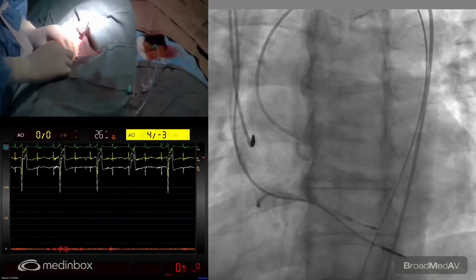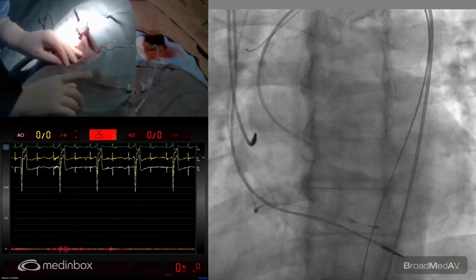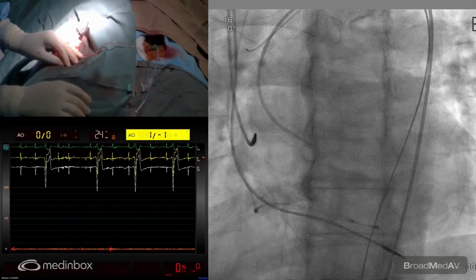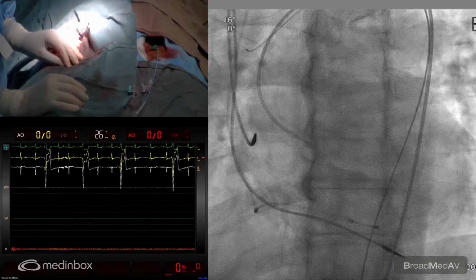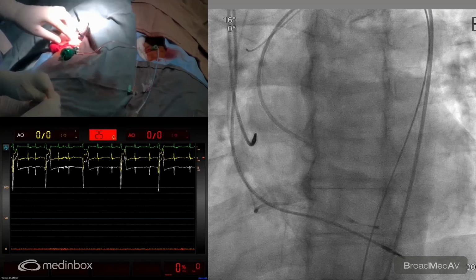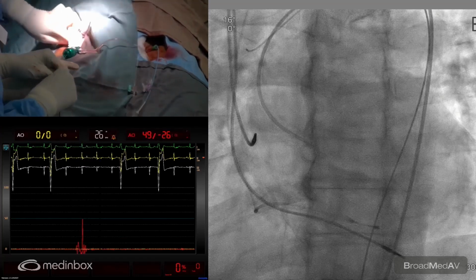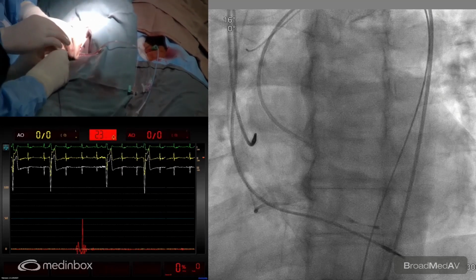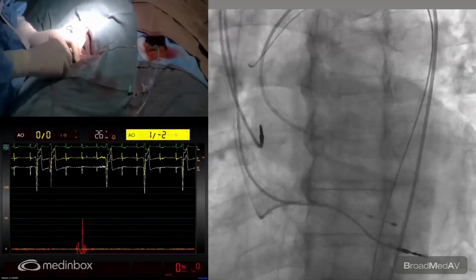The only question is now whether to dilate it because of the AR. I will keep the valve ready and then dilate it. Why is he bleeding? So now let's get the wire. You want a Terumo or a straight wire? Straight Terumo, please, double length.